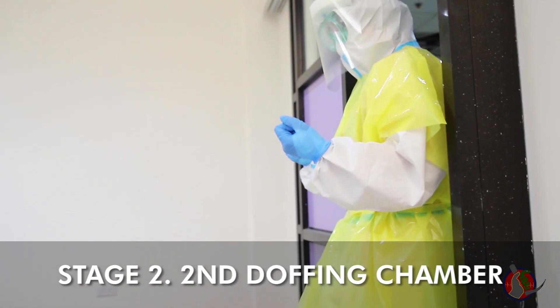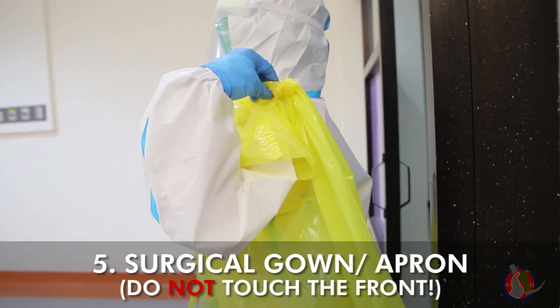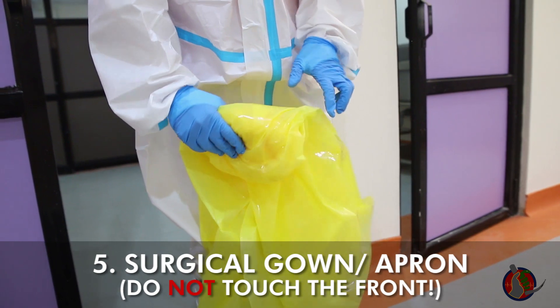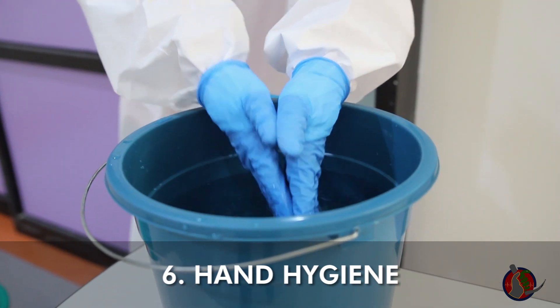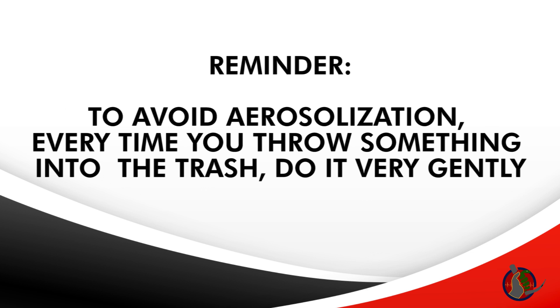Proceed to the second doffing chamber and step on the foot bath. Remove apron or surgical gown by detaching from the back, then rolling downwards slowly exposing the clean side out, then throw very slowly in the trash bin. Do not touch the front. Do hand hygiene with the hypochlorite solution. Wear a new glove on one hand if there is a door to the doffing room, then throw the glove gently. To avoid aerosolization, every time you throw something into the trash, do it very gently.